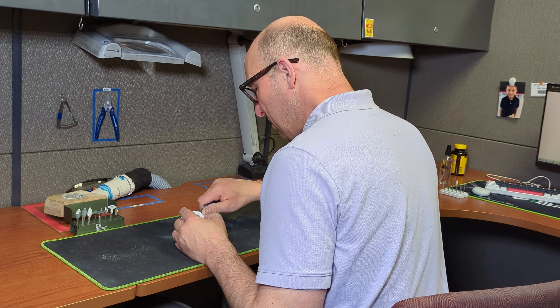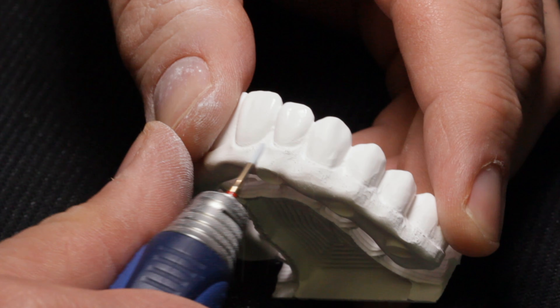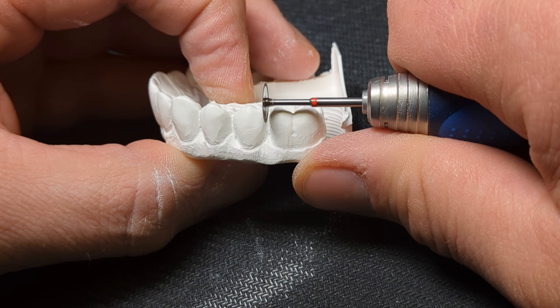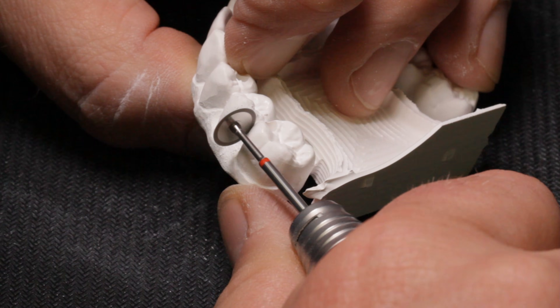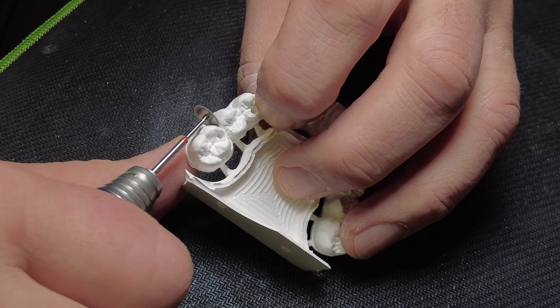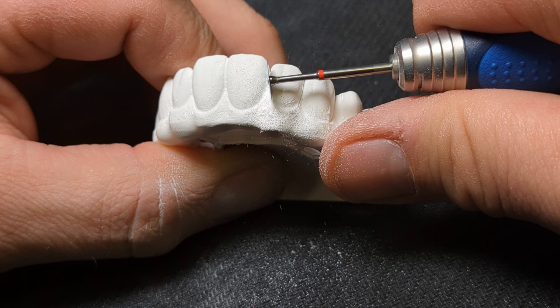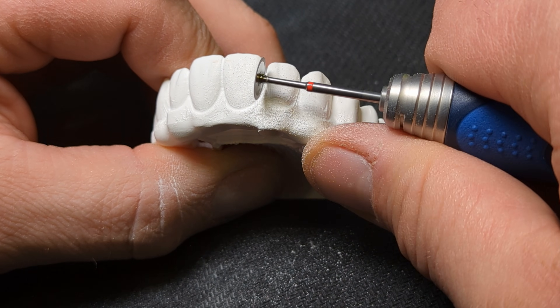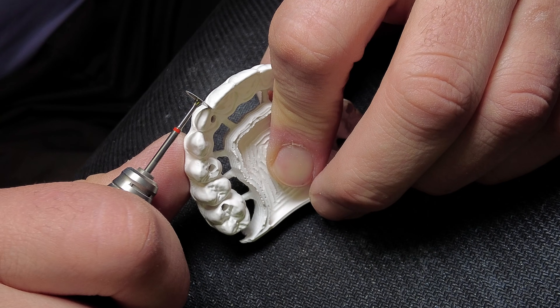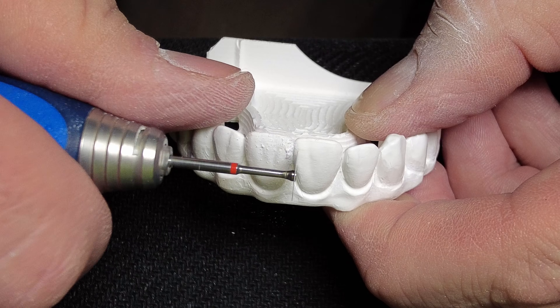I see many technicians using diamond discs on zirconia after sintering. Ninety-five percent of the contouring of monolithic full-arch cases is done in green stage, so I spend the most amount of time in this step. The most beautiful Mio layering technique won't compensate for a bad contouring job. I love the small diamond disc from Brussela because it is small and flexible enough to open up interproximal areas.